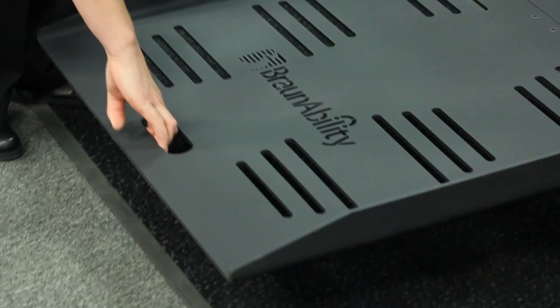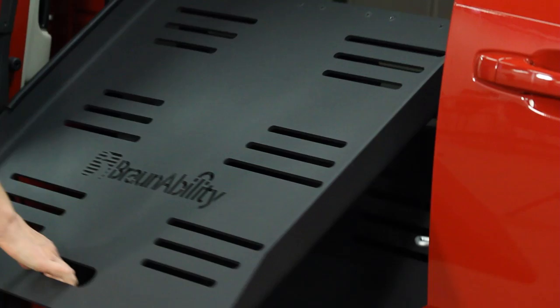To raise the ramp for stowing: first, lift the ramp from the handle; then fold into a stowed position; and finally, close the door.